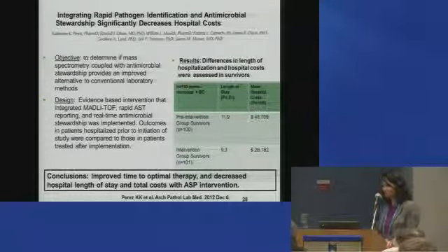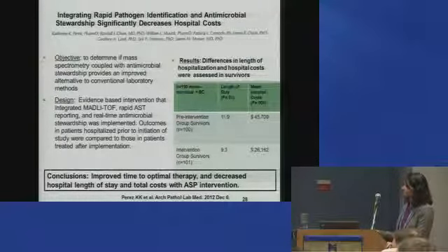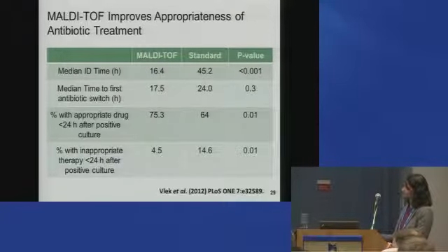This is kind of amazing because our antibiotic stewardship team is pretty much, we give them the answers from 9 to 5, okay? And they intervene up to 5 o'clock. We are still sending them the results, but they intervene the following morning for anything that's after 5 o'clock. But Dr. Perez, at least for the purpose of the manuscript, or maybe she's doing it now, I don't know, they were actually 24/7, so they were getting these answers in real time and then intervening, talking with the clinicians.